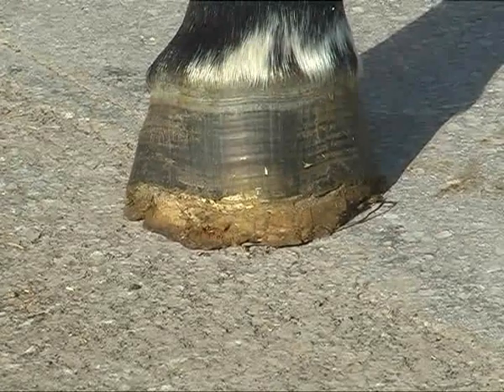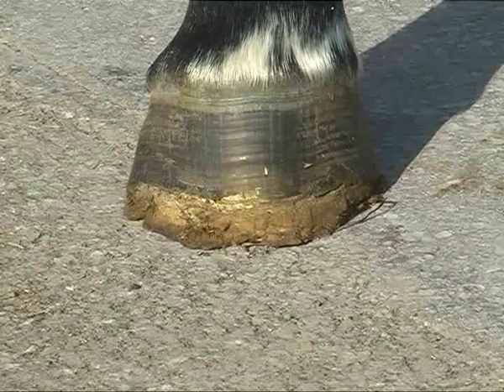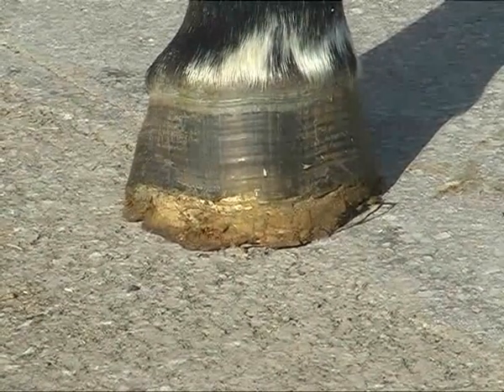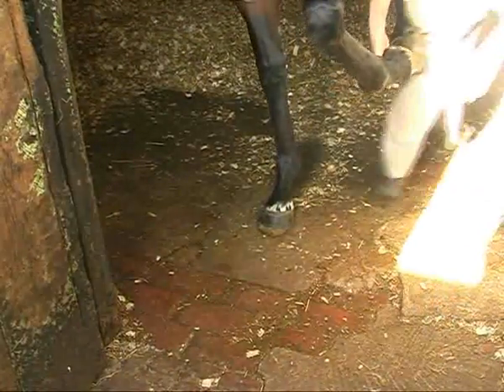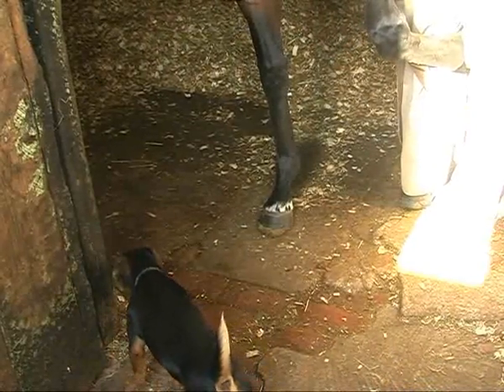What we intend to do today is to put another pair of cuffs on her. We'll then nail some plates on the bottom of those and we'll see how much more comfortable she is after she has the plates back on. I'll dress the solar surface off, put the foot forward, and remove this flare before we fit the cuff, so we'll have a good sound square surface on which to work.